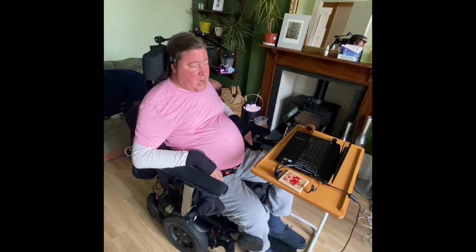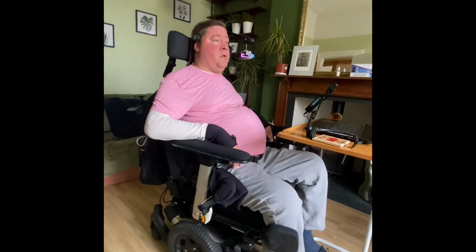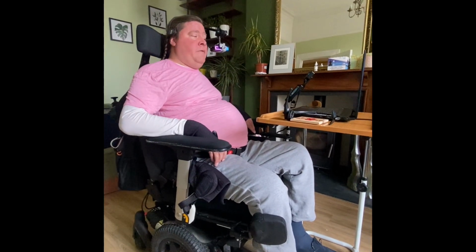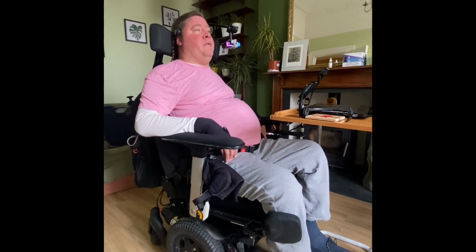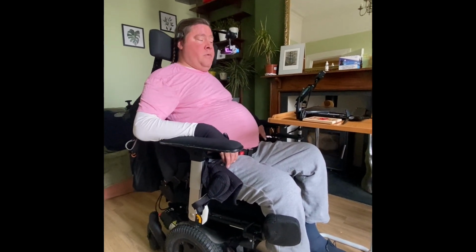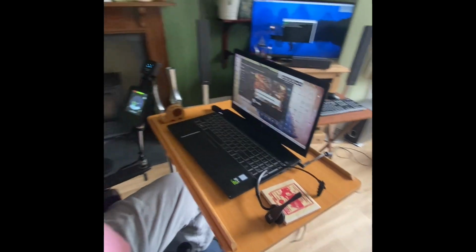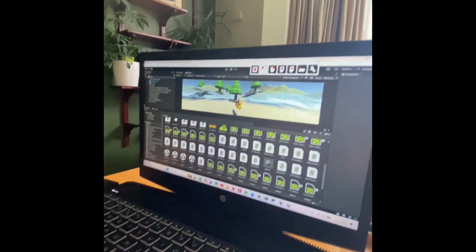Now, for safety reasons, I wasn't going to test the flight controller algorithm with hardware, and also it wasn't within the scope of this project to do so. So what I developed was a Unity world and a script for head control movements of a flying vehicle. So I'm going to show you next the simulation in Unity, and that will demonstrate how the system works in terms of allowing you to fly. So this is the Unity setup.